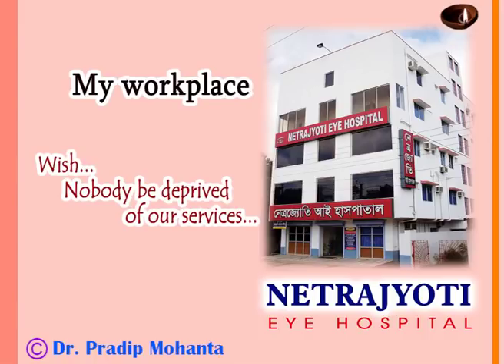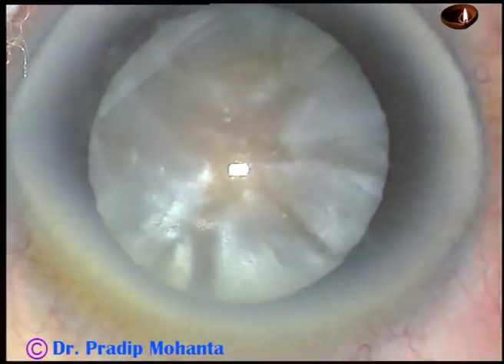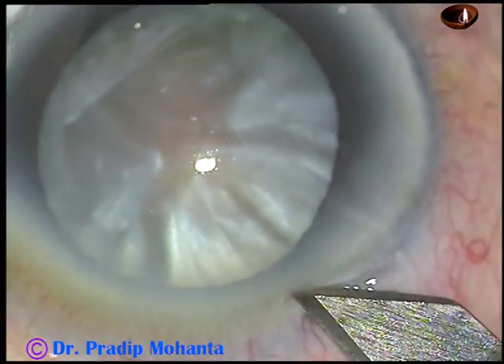Dear colleagues, welcome to my hospital at Ranaghar, West Bengal, India. This is an intumescent cataract with hard nucleus. Let us observe the surgical steps.